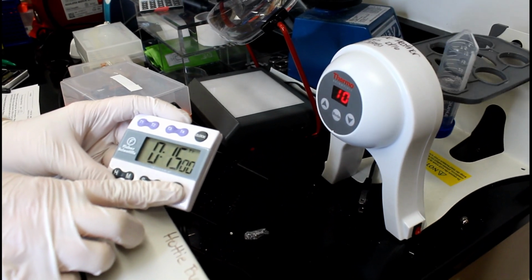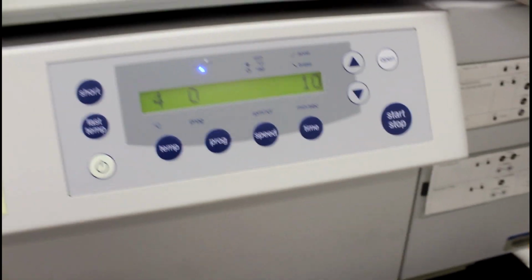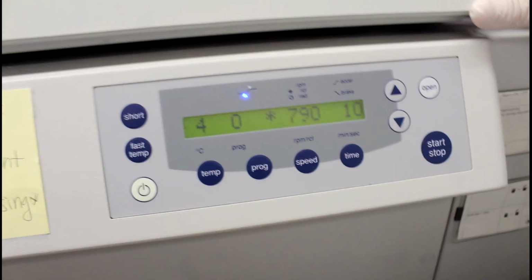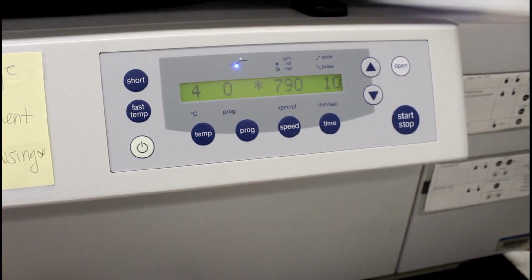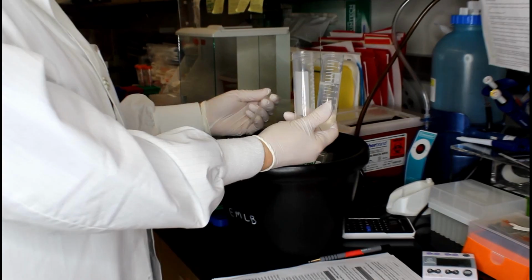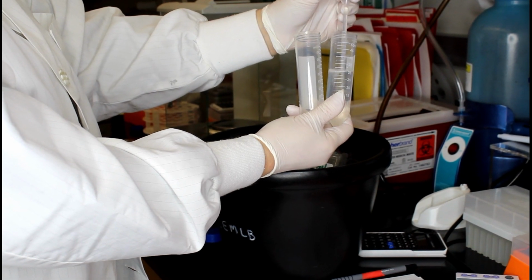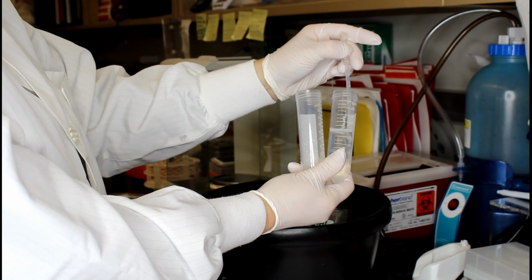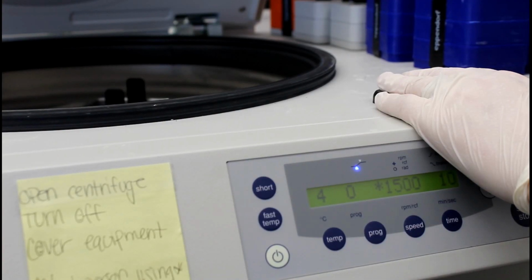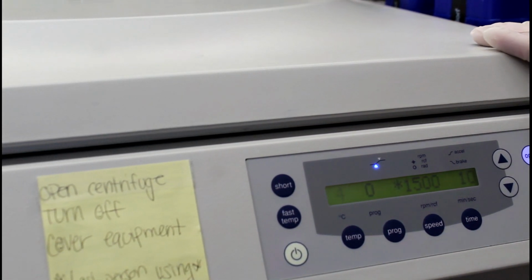Homogenize the sample for 15 minutes on a rotating tumbler. Once the sample is finished on the rotating tumbler, it is centrifuged at 790 G for 10 minutes. After the sample is removed from the centrifuge, remove half the volume of supernatant and dispense that into a separate tube. The removed supernatant is returned to the centrifuge. The settings are 1500 G for 10 minutes.